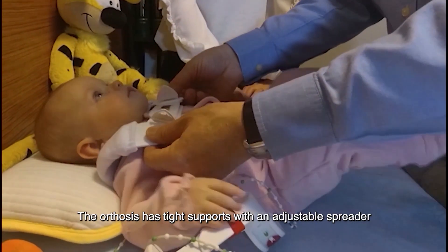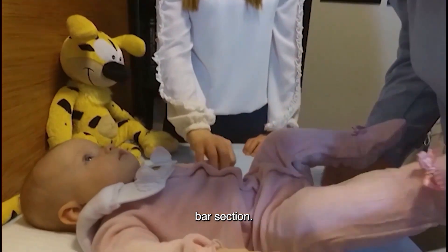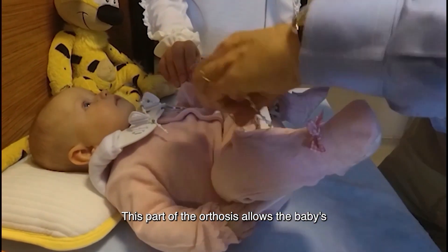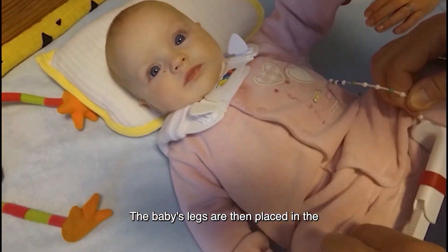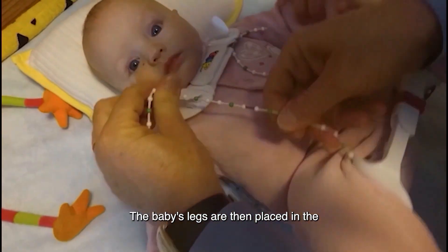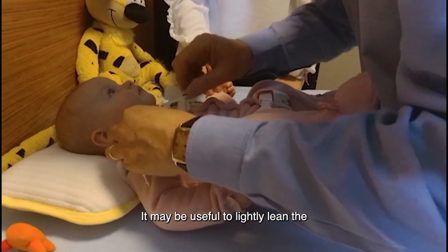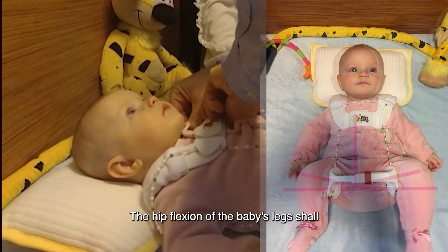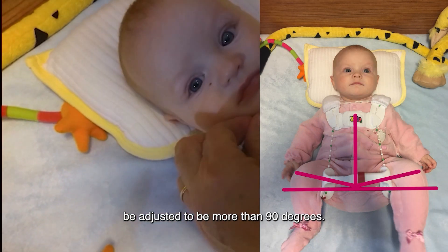The orthosis has thigh supports with an adjustable spreader bar section. This part of the orthosis allows the baby's legs to be abducted to the sides. The baby's legs are then placed in the thigh supports. It may be useful to lightly lean the baby's feet on your belly at this step. The hip flexion of the baby's legs shall be adjusted to more than 90 degrees.